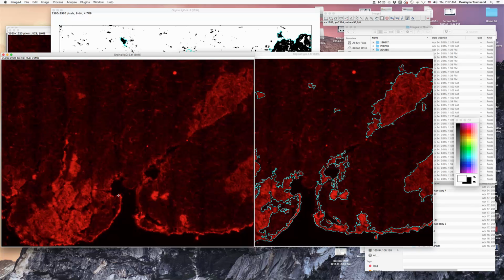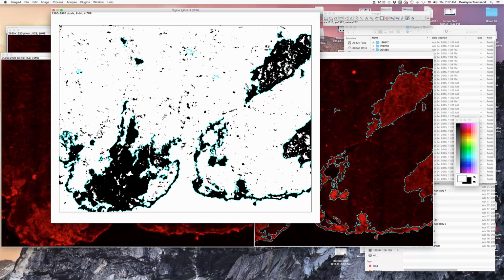These are not indicative of damage, so we don't want to include them in our analyses, but they do come back positive. So again, we're going to have to use our little tool to get rid of this whole area here and some of this area here, but not all of it, because you can see that there are some positive myocytes in here, although it may have expanded this area a little more than it ought to have.